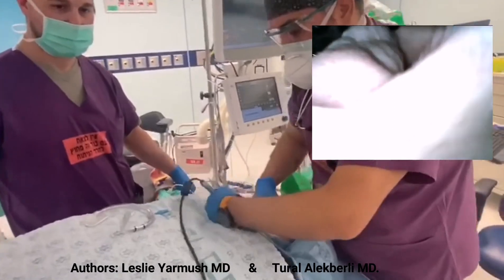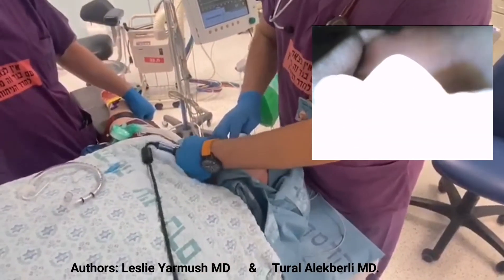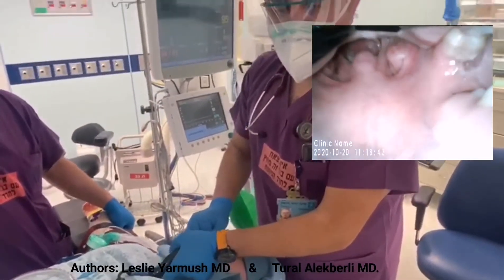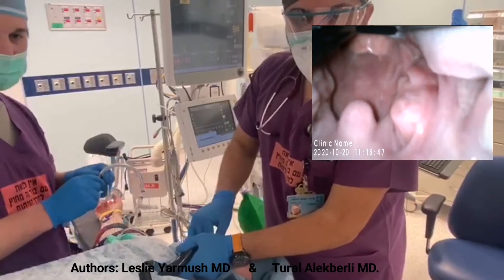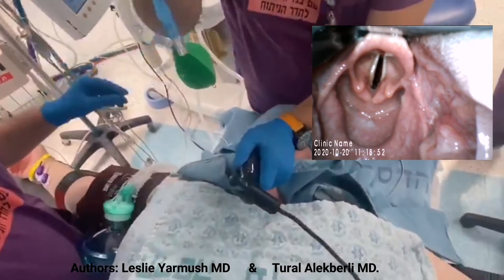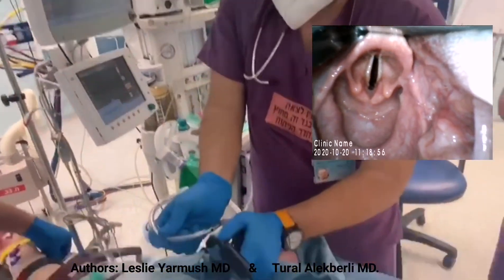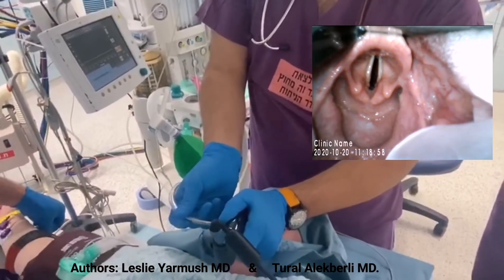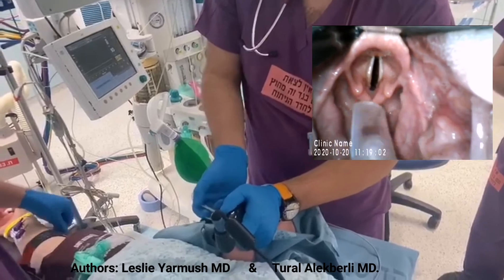I'm inserting the blade into the mouth centrally, passing the tongue, putting it into the vallecula and elevating the epiglottis. Then inserting the tube once the vocal cords are visualized in the middle of the screen. As you can see, the tube is going directly to the vocal cords.